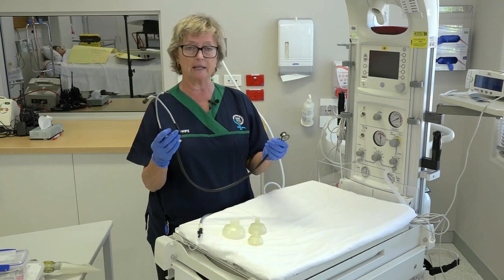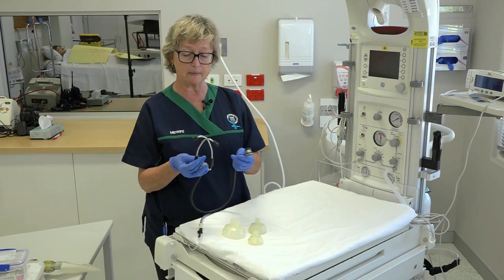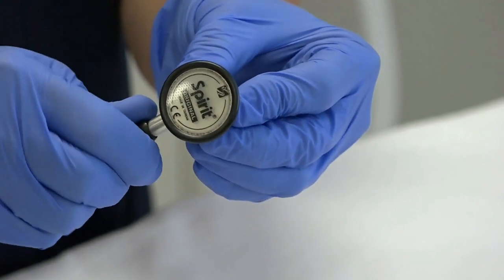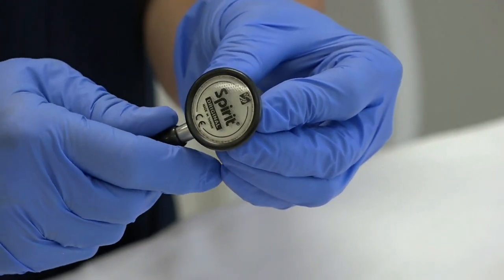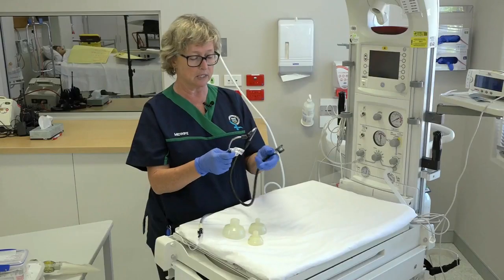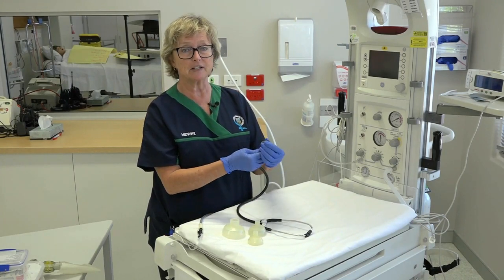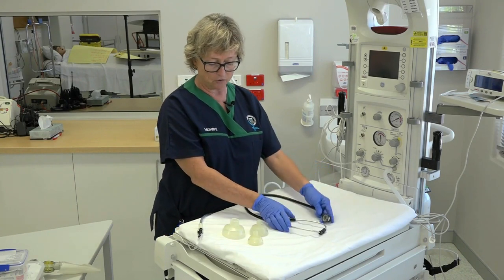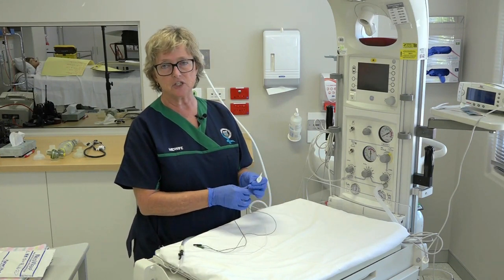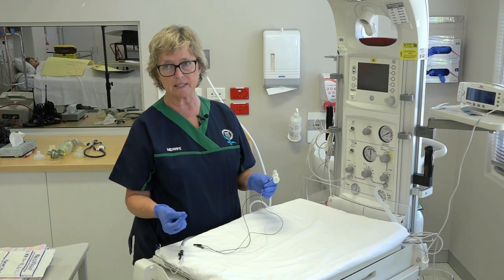We have here a neonatal stethoscope, which is required to auscultate the baby's heart rate. It has a smaller diaphragm and dome especially for the newborn. When using it, the ear pieces should be facing forward and the dome or diaphragm must be rotated the right way so that you can actually hear the heart rate. The most recent guidelines suggest that a three-lead ECG is more effective in picking up the heart rate than palpating the umbilicus or auscultating the chest.